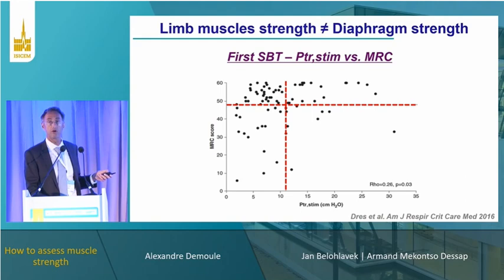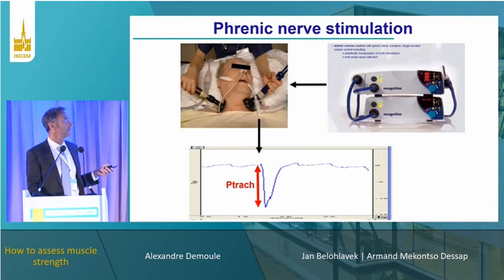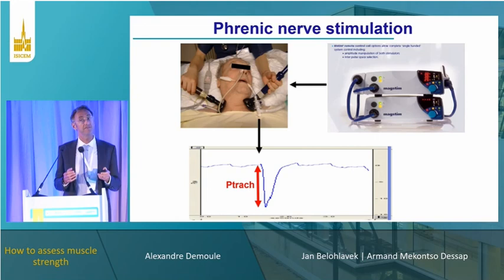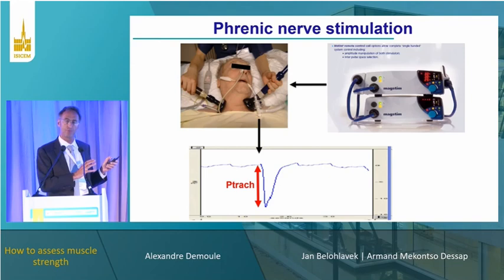But we have tools that we can use. First, we have pressure, and second, we have ultrasound. So let's start with pressure. If my patient is still sedated and not triggering the ventilator, if there is no spontaneous activity of respiratory muscles, unfortunately there is only one technique you can use. And I would say that less than 1% of you have this technique. We use it mostly for research and for expertise in very difficult to wean patients. I'm just showing you this, but it's very difficult to bring it back to your units. The rest of my talk, you can bring back to your units.